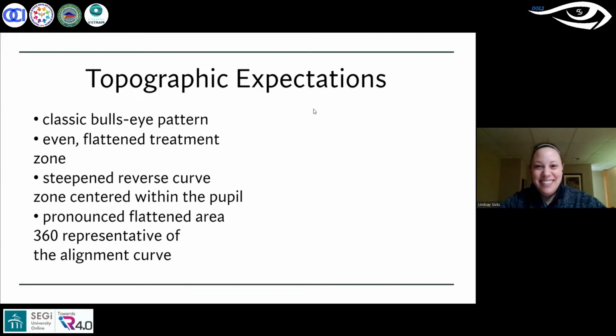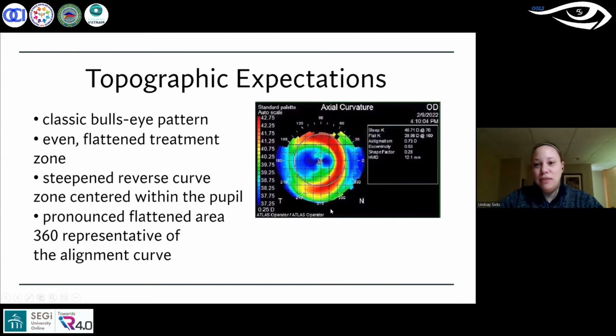So about 41% of them think tangential, followed by 35% who think axial, and the remaining think it's the difference map which helps us to do that. Right. So the majority were right. We want to look at our tangential map. So let's see, and I'll show you an example here. You can kind of see why.